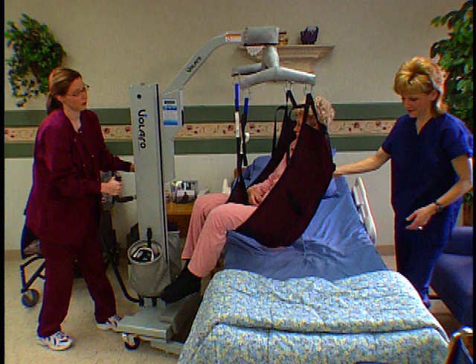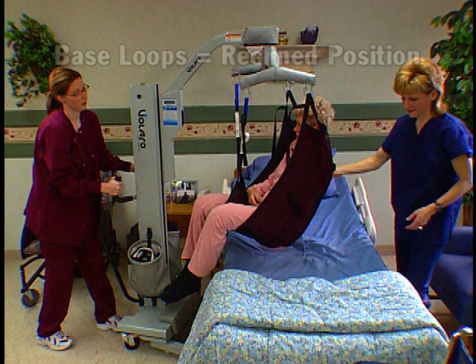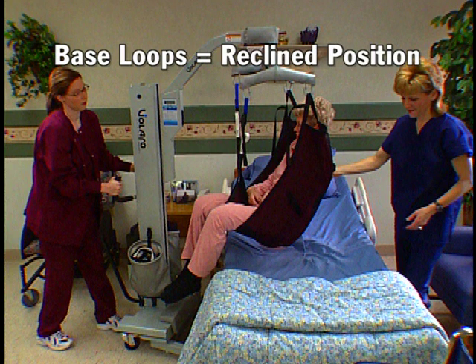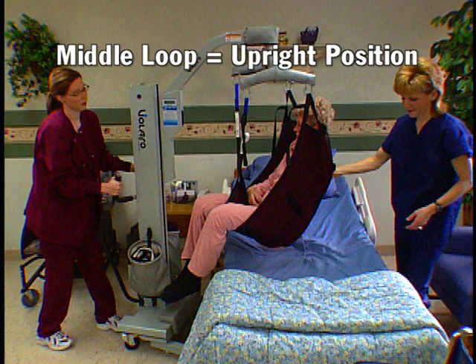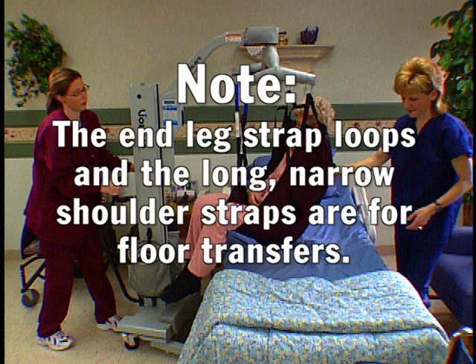When connecting the leg strap loops, it is important to use the same color-coded loop on each strap. By using the loops at the base of the leg strap, the person will be in a more reclined position. When using the middle loop, the resident will be in a more upright position. Most caregivers use the middle loop. Note: the end leg strap loops and the long narrow shoulder straps are for floor transfers.